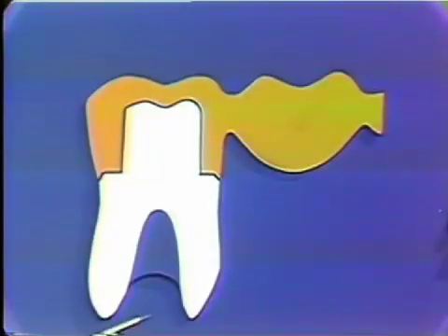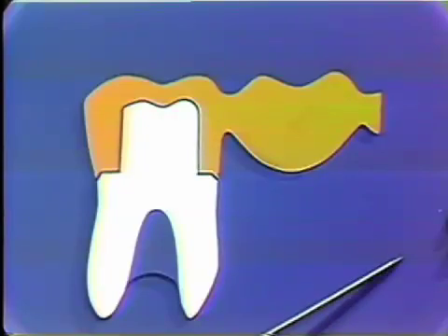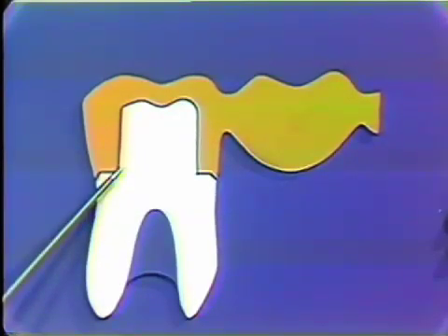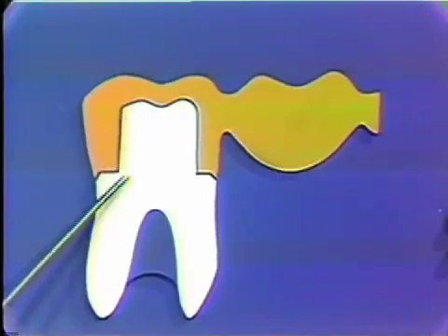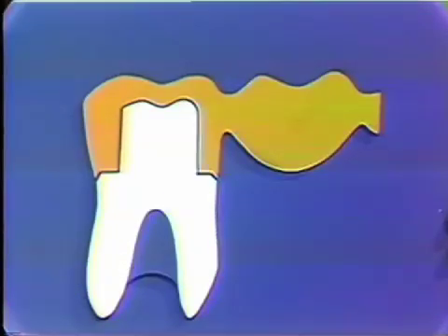Here is a similar bridge to the last one, with a molar tooth here and a bicuspid here, not shown in the diagram. But in this situation, the preparation is a little different, as you'll recognize. The crown of the preparation here is longer, and the distal and mesial surfaces are not so tapered as was previously the situation. Now, let's see what the effect of the anterior component of force is on this situation.